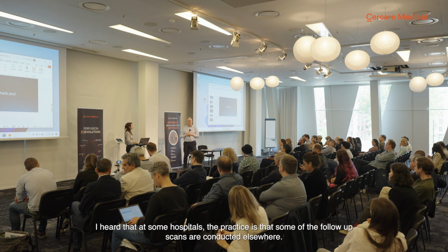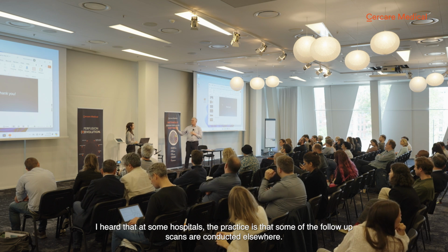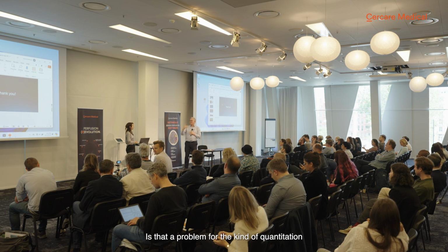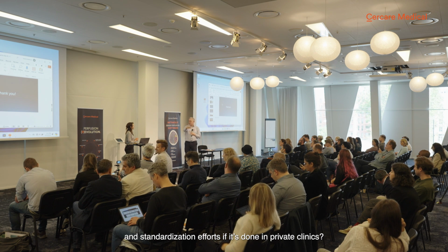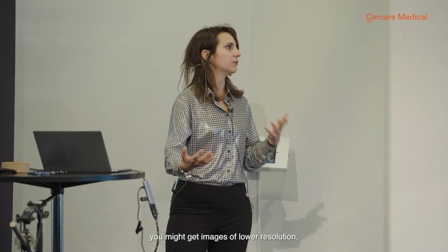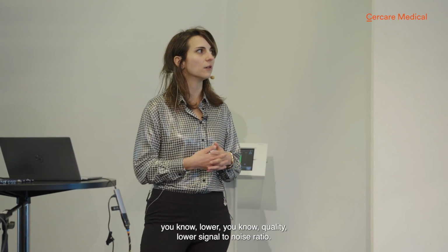Right. I heard that at some hospitals, the practice is that some of the follow-up scans are conducted elsewhere. Is that a problem for the kind of quantification and standardization if that's done, let's say, in private clinics? For sure, because you might get images of lower resolution, lower quality, lower signal-to-noise ratio.